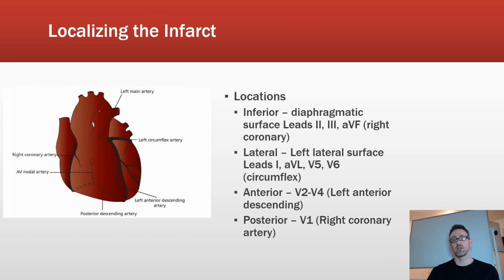Now, what's clinically useful in interpreting the ECG is to get at least a rough idea of the arteries that might actually be causing the problem, or where there might be some sort of an occlusion. So remember that the heart receives its blood supply through the coronary arteries. And the coronary arteries come off of the aorta, the initial portion of the ascending aorta, right above the aortic valve. And you can see here we have the left circumflex, heading towards the left ventricle.